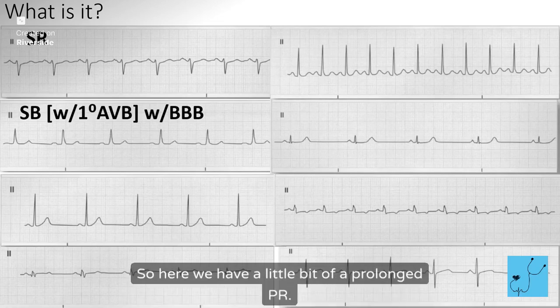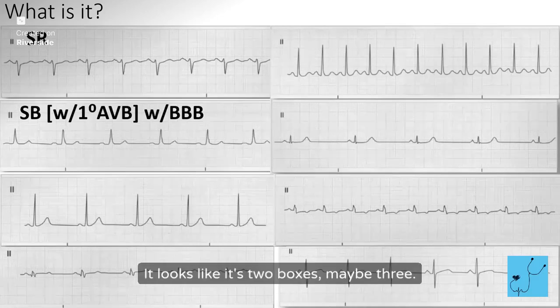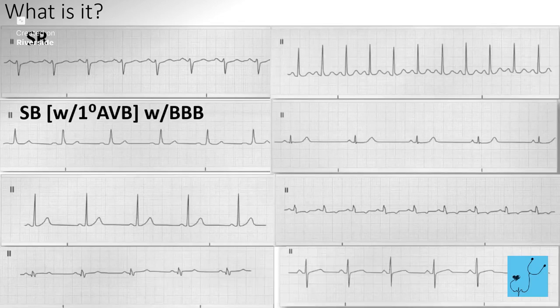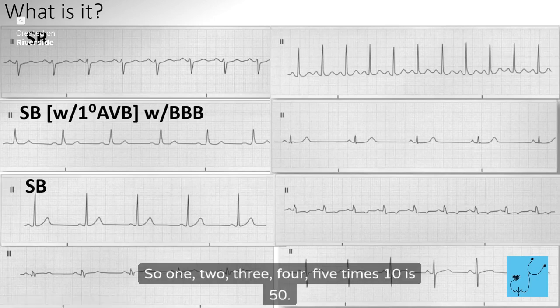So here we have a little bit of a prolonged PR. And then maybe a bundle branch block, it looks like it's 2 boxes, maybe 3, that may be a little bit of a stretch to be a bundle branch block. But the PR is prolonged here. What about this one? Yeah, sinus Brady. So 1, 2, 3, 4, 5 times 10 is 50.